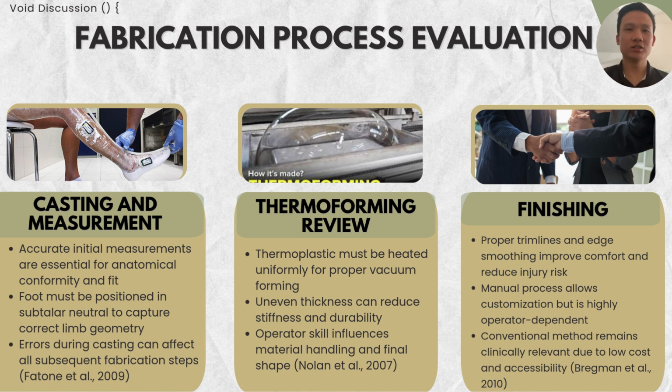It's me again. I will present this part, which is the fabrication process evaluation. In this part, our main focus is the casting, the thermoforming, and the finishing process. Accurate casting is very essential to ensure a good anatomical fit, and error at this stage will affect the entire size and the fabrication process. Next, during thermoforming, uniform heating is very crucial to avoid uneven thickness, which can reduce the stiffness and the durability.